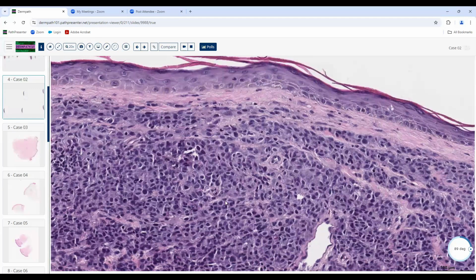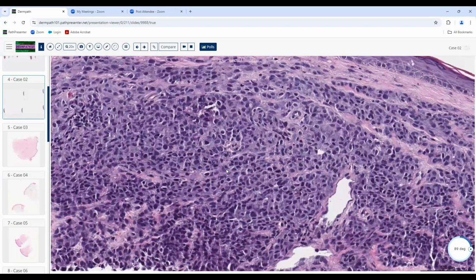There's another large atypical cell. We're going to pull back and say, even though it looks benign, kind of at low magnification, seems to be small and symmetrical in some of those features, we're going to say this very well can be a malignancy.